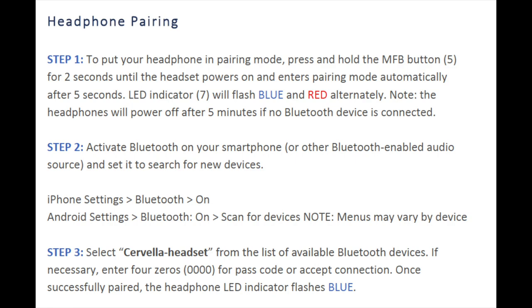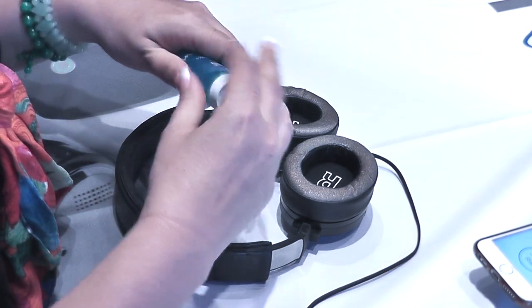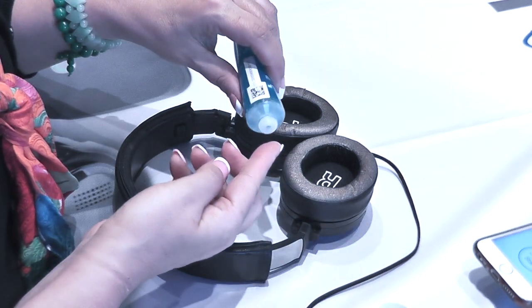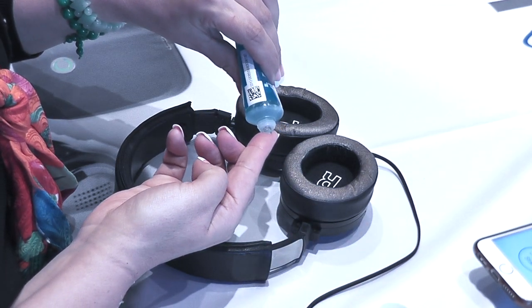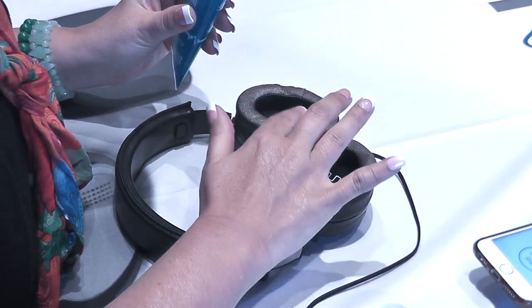Your Cervella device is now ready to use. Ensure that the Cervella device and your stereo headset are charged prior to use, as you cannot use the Cervella while it is being charged. Make sure that the skin around your ears is clean of oil and makeup.